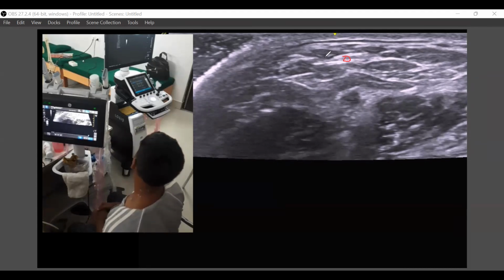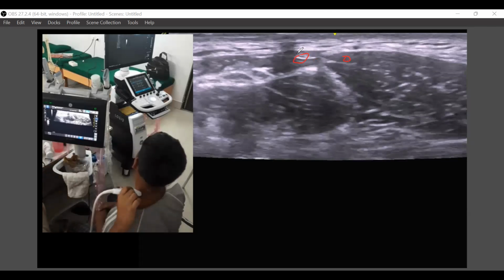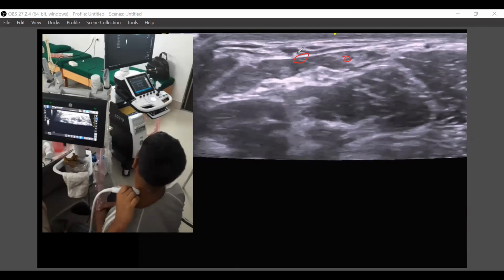It was initially coming below the sternocleidomastoid, and then it gradually became superficial. I'm showing you again. And when we'll be tracing, the one nerve will be coming a little bit laterally, posterolaterally, and another nerve will be going anteriorly. I'm just again showing. You just look at this here.